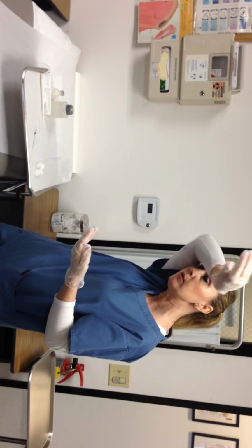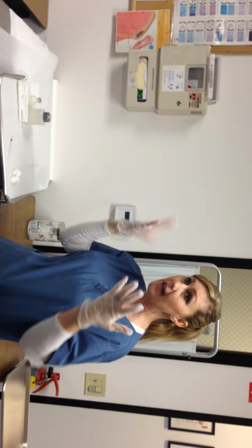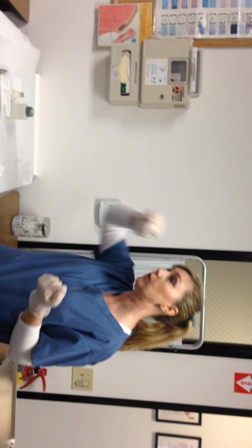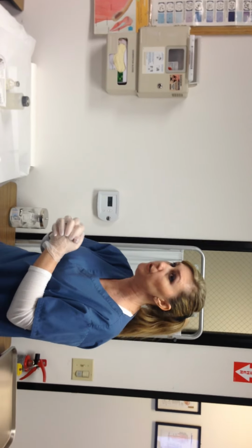Notice my hair, I'm doing this. Notice I don't go like this, okay? If I do that, I got to go change my gloves, okay? So I'm getting it out of my eyeball, but I'm not touching it with my hand. Oh, and they notice too. They will notice, and especially if I'm your patient.